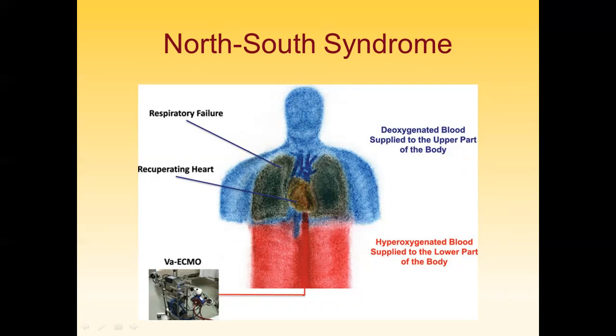It matters if you cannulate not in the femoral, but your cannula position, if you're going from the femoral, will not change. Your arterial cannula is about 15 centimeters long, and it will usually just be planted in the iliac. It may reach into the aorta, but it's usually just sitting there. So advancing catheters, you can't advance it far enough.